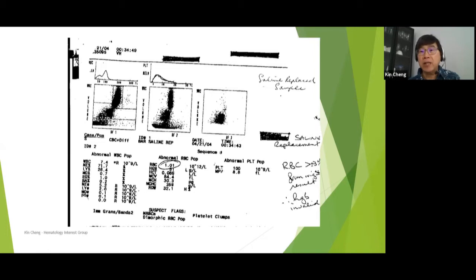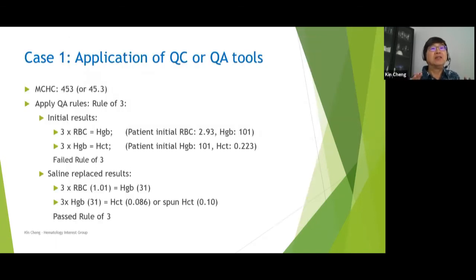She took a look at the slide. And that is something that technologists sometimes, when they see something abnormal, they basically freeze. They didn't know what to do. So she said, okay, all these things are telling me there's something not good, so I better look at the slide, right? Yeah, this is all the things that she did, and you can go back to this slide later.